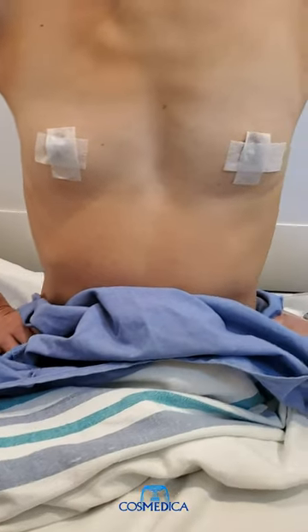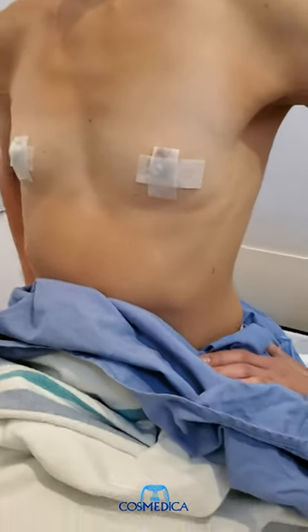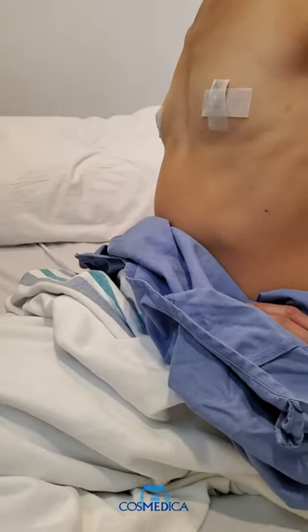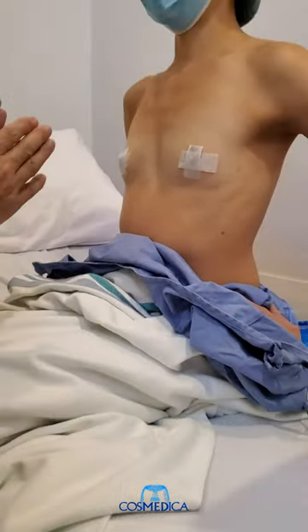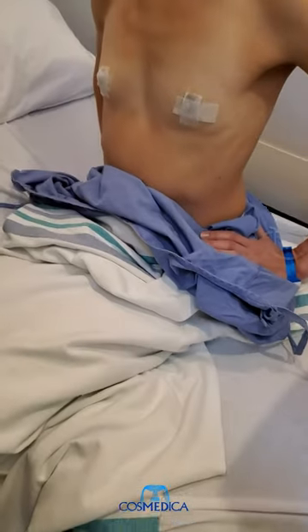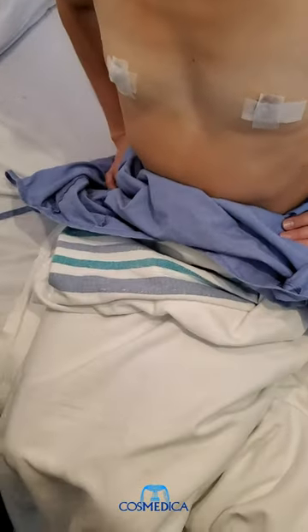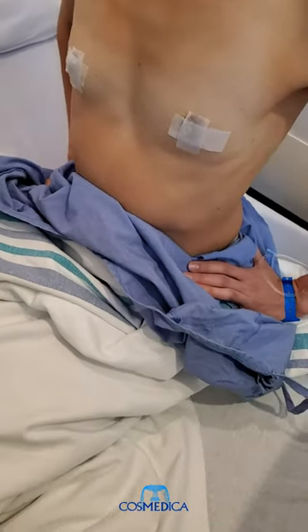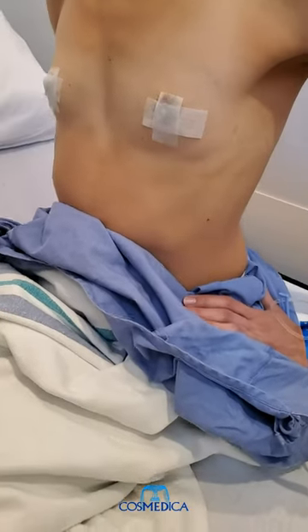Today we're going to do a breast augmentation on this patient. She has selected a 240cc silicone gel implant, medium profile. The medium profile will fill out her breast diameter very nicely, and the 240cc will give her a moderate projection and an increase of about one and a half cup sizes.